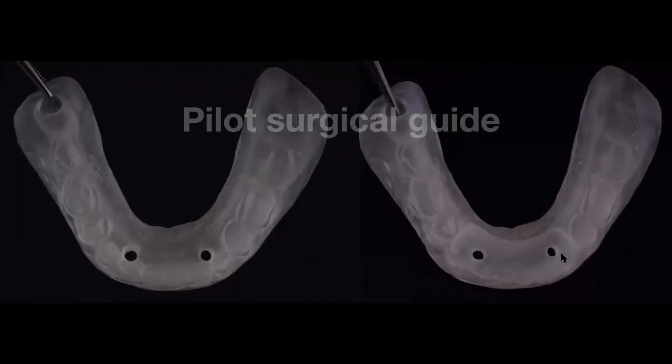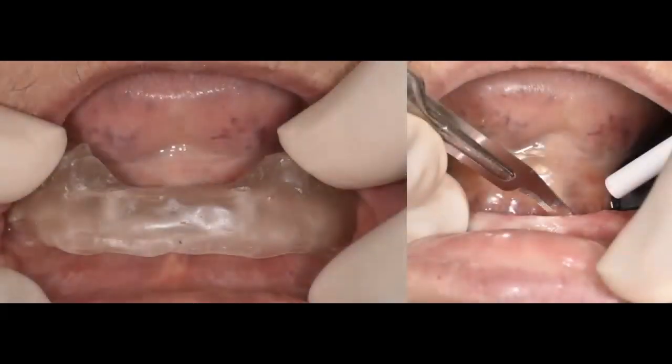And again, for this particular case, where you saw that there was enough bone height and enough bone width, this is a good option, an easy to use, easy to fabricate surgical guide that you can fabricate yourself in your office, and you don't have to send this to the lab to get duplicated and add more cost to your surgical procedure. So that's why I wanted to share with you this nice tip and trick today as well.